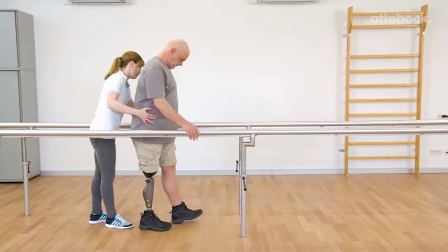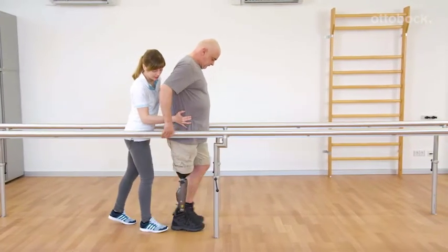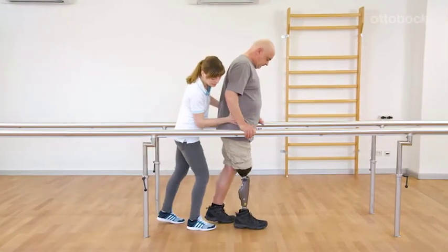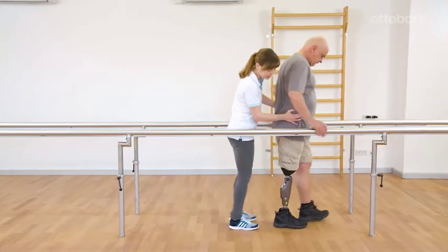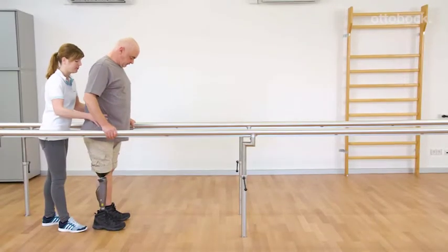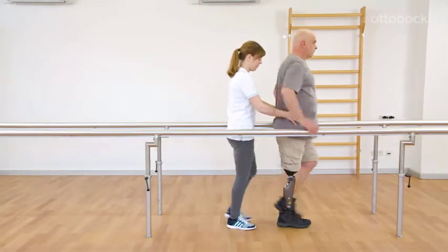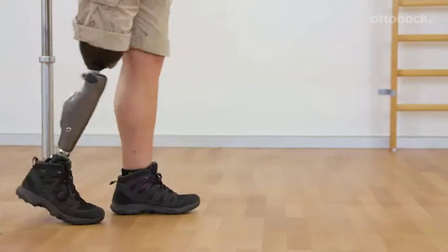Gerhard tries to use the motion sequence during consecutive steps. It requires time and training to integrate this natural knee flexion. Consciously walking with stance flexion should be trained over and over again. Especially train this movement when walking outside of the parallel bars and during outdoor training.